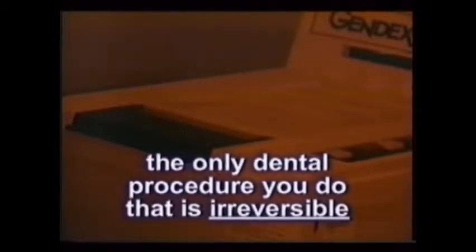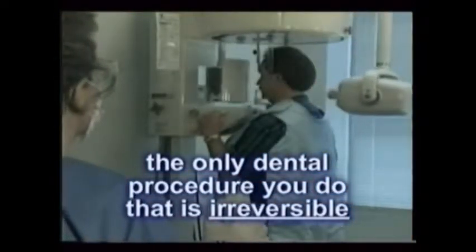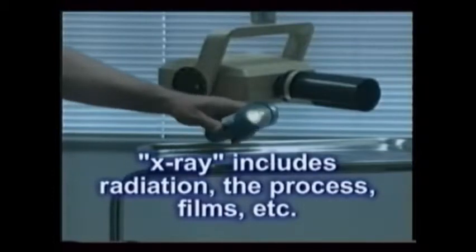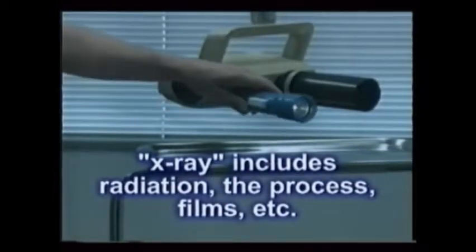Exposing and developing X-rays may well be one of your most valuable contributions as a dental assistant because of the importance of X-rays in proper diagnosis. In addition, X-raying patients is the only dental procedure that you do that is absolutely irreversible. That alone tells its importance, and we'll discuss the risks that accompany X-ray use in just a minute. Before we continue, for simplicity's sake, please notice that we'll use the term X-ray to include the radiation, the process, the films, and other aspects interchangeably.